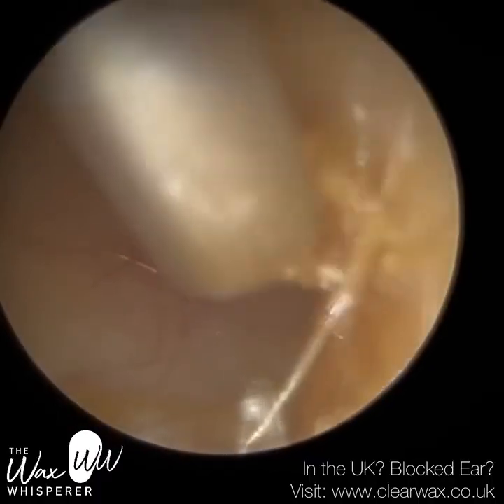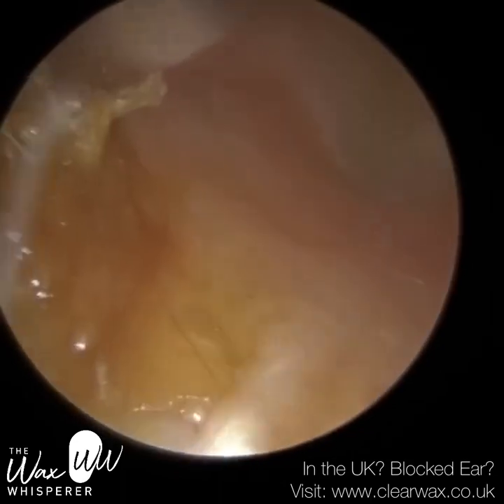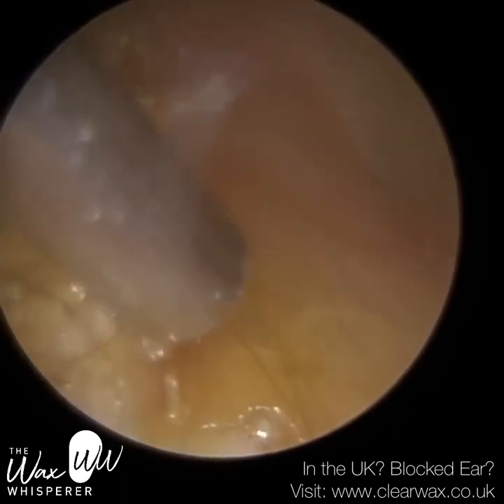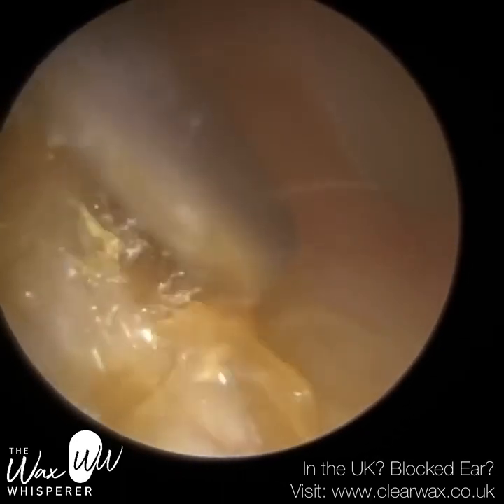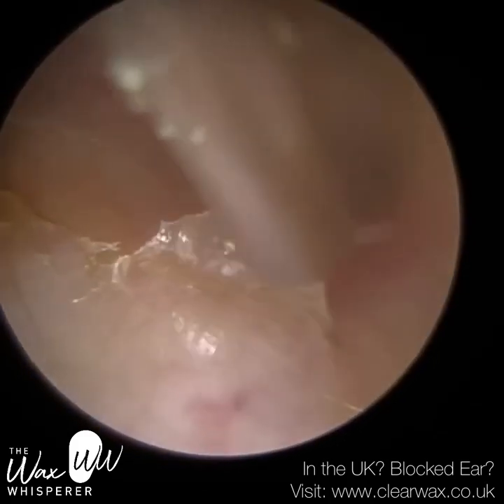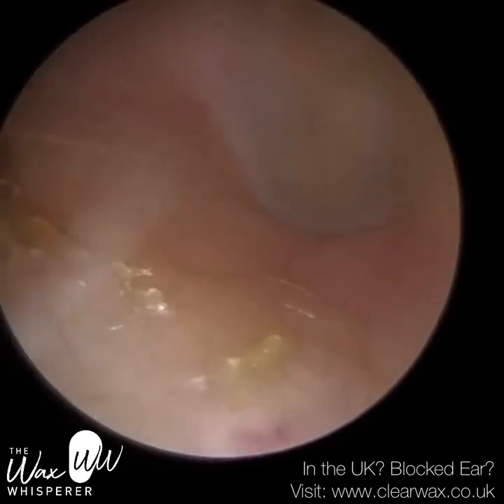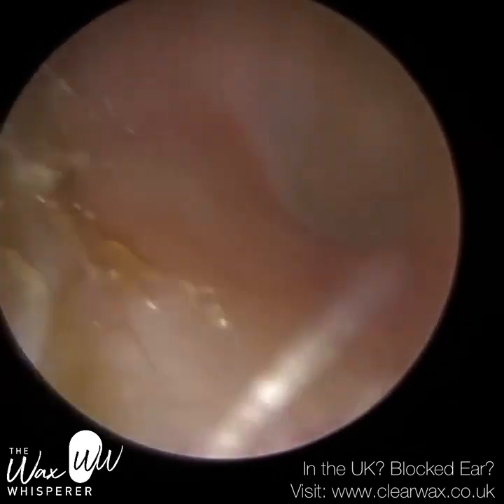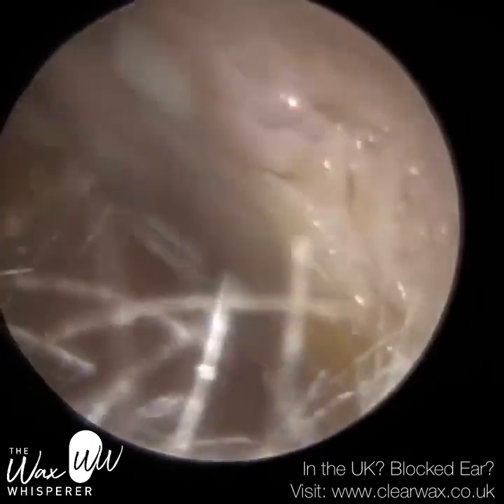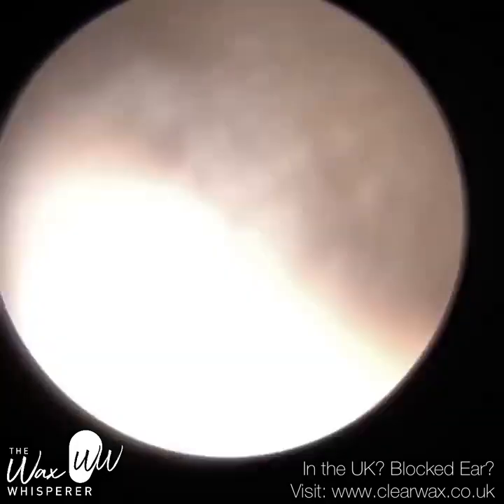The tube itself is around, I believe, 9.5 centimetres and around 3 centimetres from the tip. So the tip of the suction probe is what you can see on screen. 3 centimetres away from that, there's a 30-degree bend on this particular Zollner suction probe. There's a bit of variation. I know some Zollner suction probes that have a 35-degree bend.